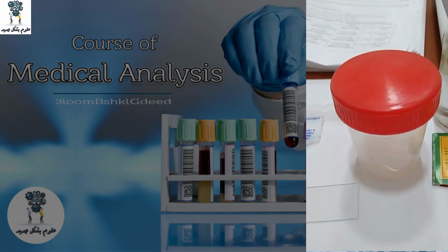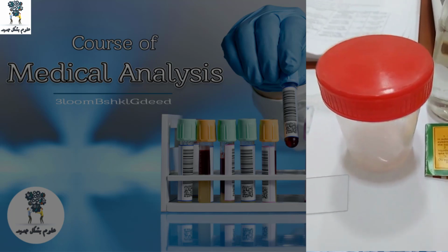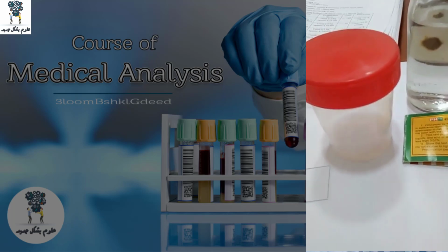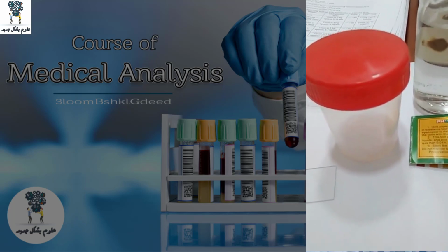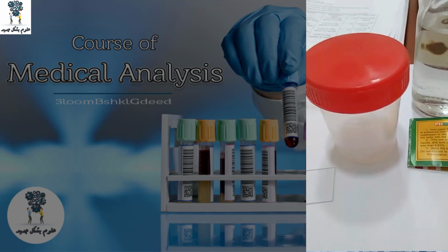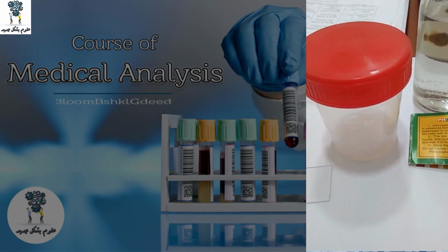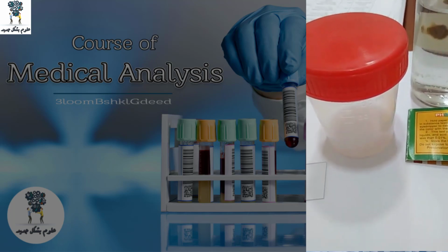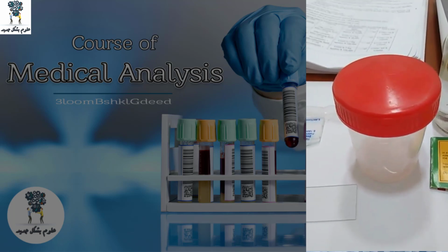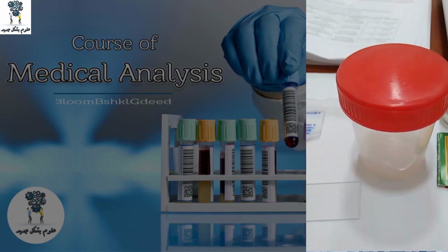But if there are 2 or 3 sperm after centrifugation, and we check the precipitate, we find like 3 or 4 sperm. It's okay. So what will we write at this moment? We will write there are 3 immotile sperm after centrifugation of the whole sample. So this case is very important, and we should follow the steps.